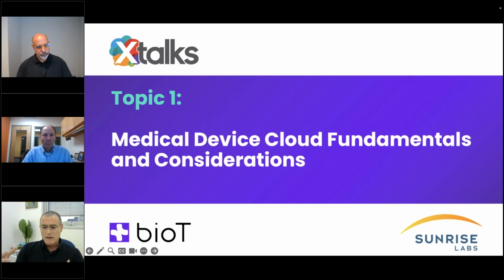All of that can be done through the cloud. And even capabilities around cybersecurity management, which we'll talk about later in the session. The cloud is an excellent tool for that, alongside the basic compute and storage power. So the more you can load to the cloud, the better.